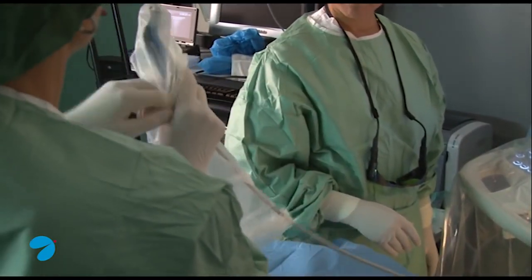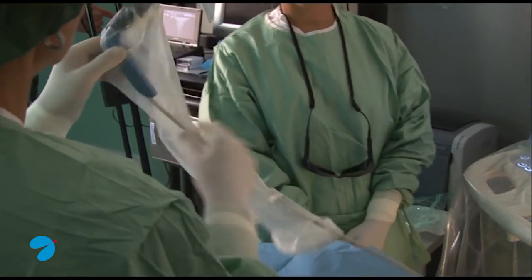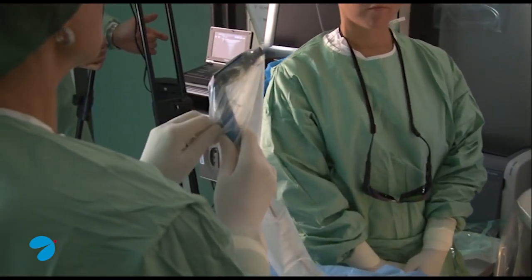In this phase, we proceed to prepare material and equipment indispensable for the laser ablation procedure.